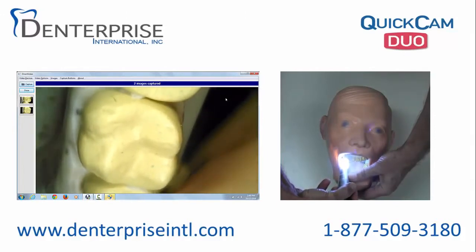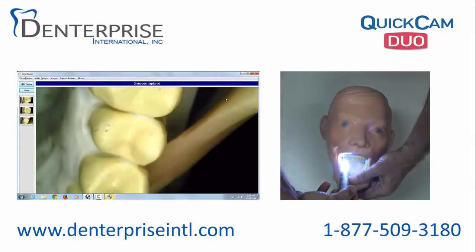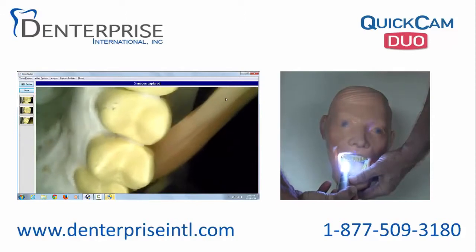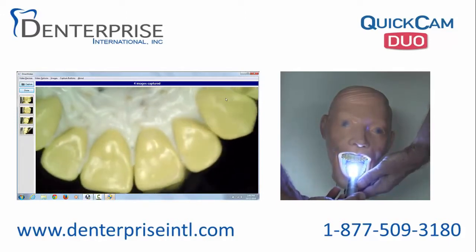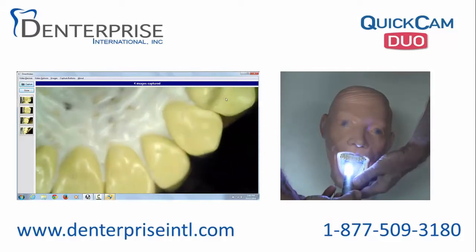It is very simple to point, focus, and capture each image. Images in this case are displayed on screen by Apteryx XV light imaging software.